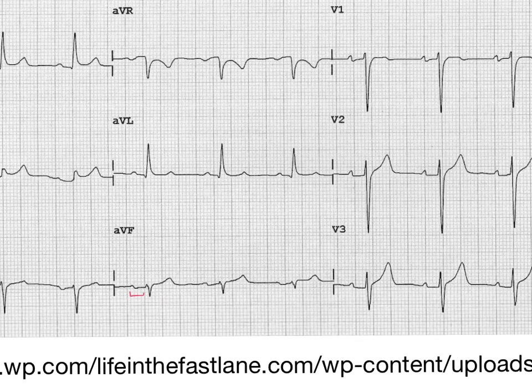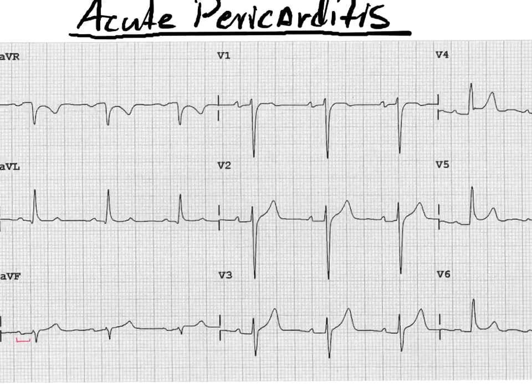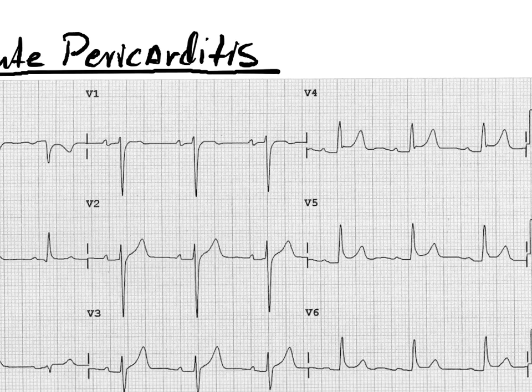Okay, well, let's move on to V1. What do you see here? Slight bit of elevation. V2, a little bit of elevation there. V3, kind of the same thing there.